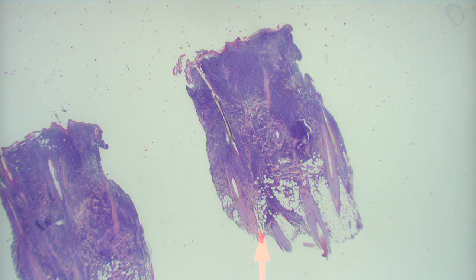So what's the diagnosis? Sort of lymphoproliferative. Okay, yeah, in the lymphoproliferative category. And you favor benign or malignant at this power? First reflex, lymphoma. Does that look good? So we're going to go to higher magnification at the end of the day and see. So we say, well, it sure looks like a lymphoma at low power.